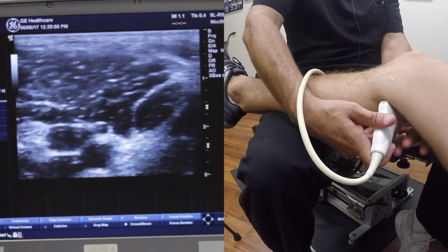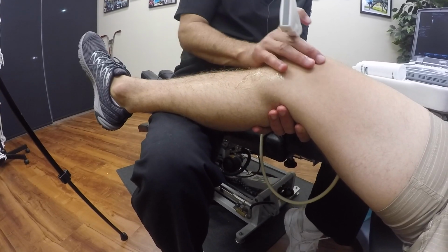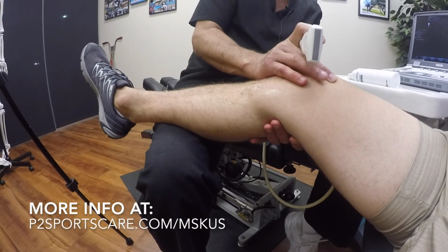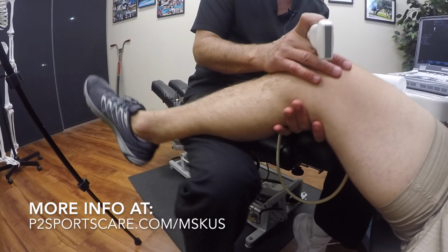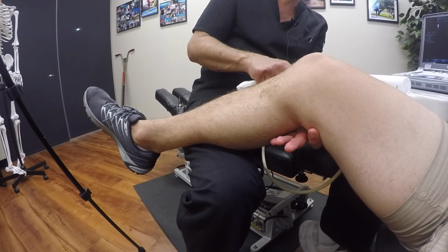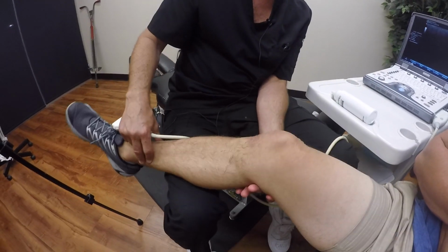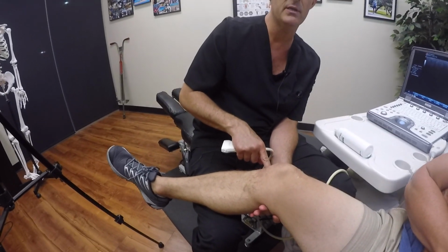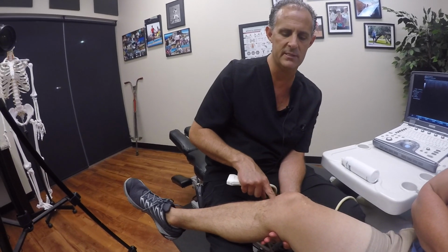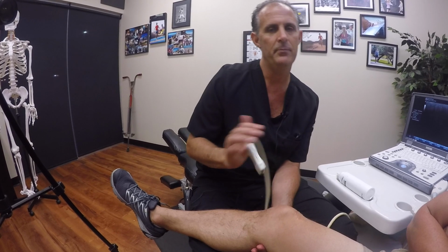So in your case, the fluid that is in excess in your knee has chosen to kind of migrate and pool up here. I think this fluid has a couple of sources. One, the changes that we saw along the lateral part of the knee and the little bit of grinding and bone spur that we saw. There is a history of a contusion out here, and there's probably a long-standing injury that could be the culprit for this fluid.